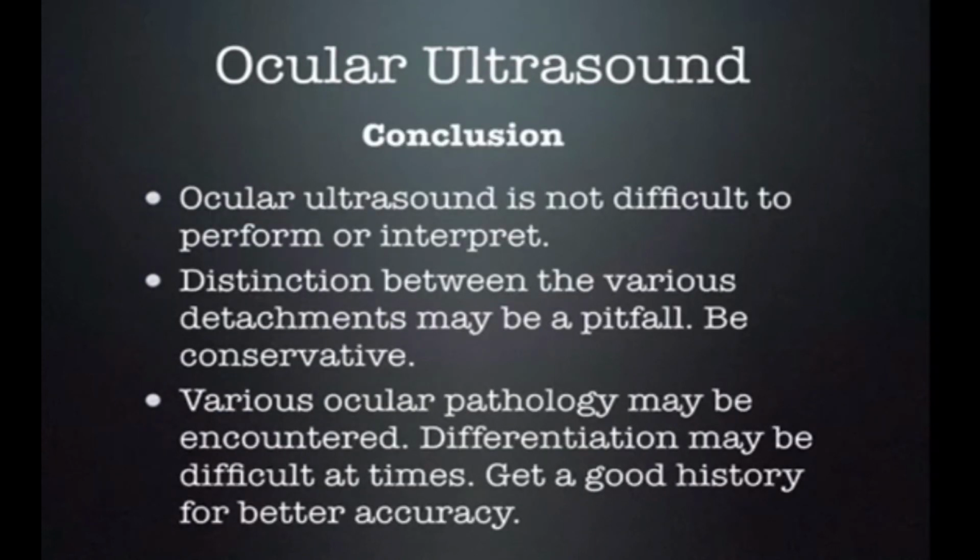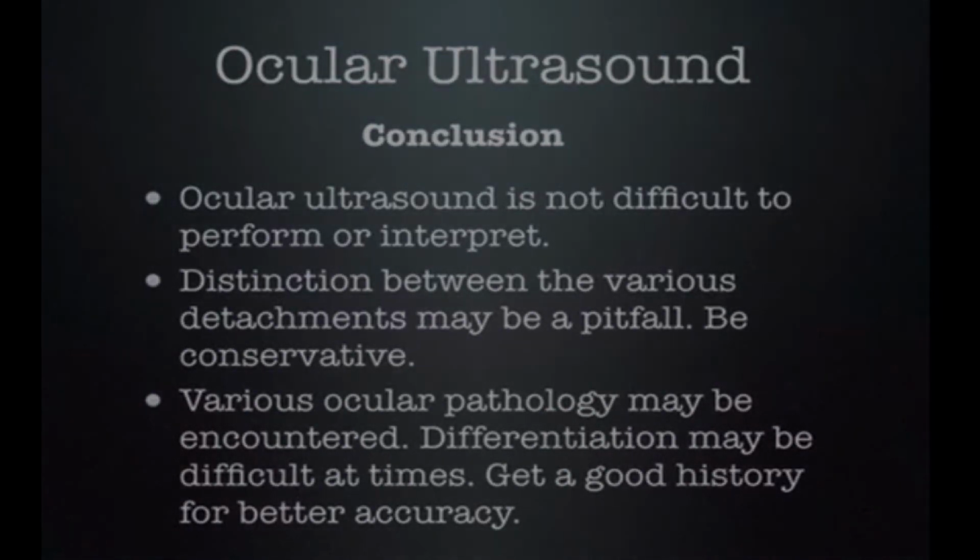So in conclusion, ocular ultrasound is not difficult to perform or interpret. Distinction between the various detachments may be difficult at times and may be a pitfall, so be conservative. Various other ocular pathology may be encountered, and differentiation can be difficult at times, so get a good history and do a good physical exam, and hopefully that'll help you with better accuracy.